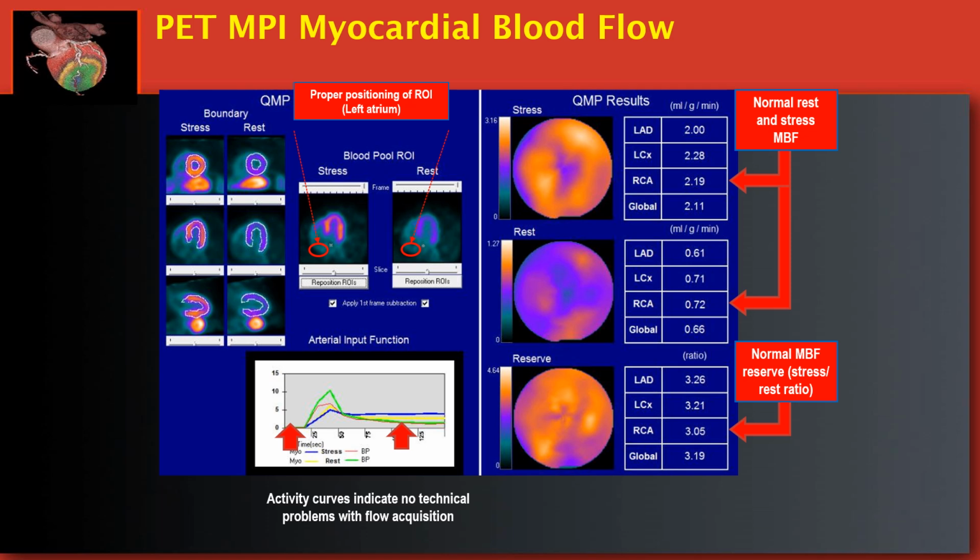If you're seeing that it goes high and it stays high and kind of levels off, that will happen sometimes with people that have heart failure, cardiomyopathy, and have a decreased ejection fraction, especially if it's really low, because it spikes as it goes through the heart, but then it stays in the blood pooling and it's not actually getting into the myocardium. So that's one of the ways that that will present.